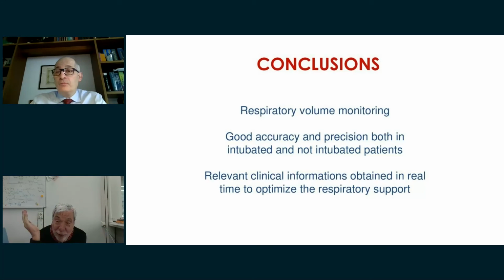I have a question for you. What do you monitor in spontaneous breathing patients? In a patient with high flow or in a patient with non-invasive ventilation? What do you monitor? Diego Ernesto asked, what about measuring driving pressure and the PMOSC?